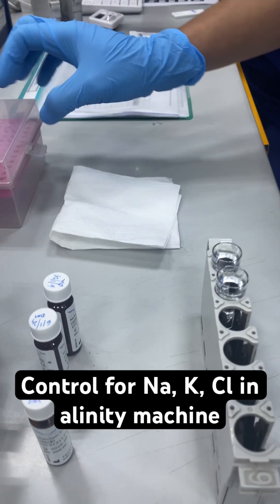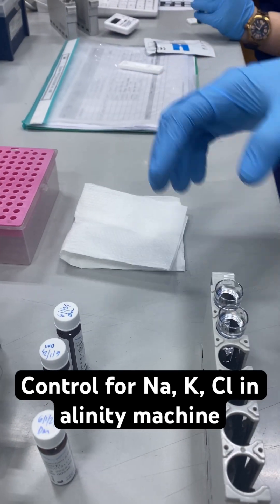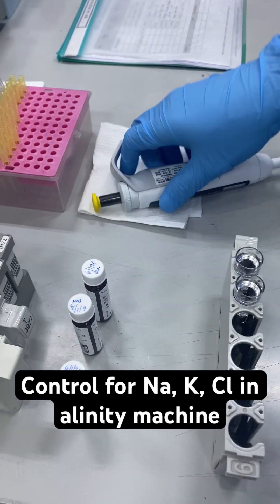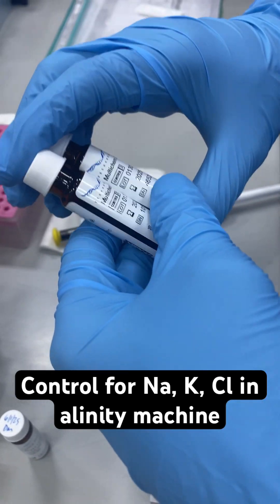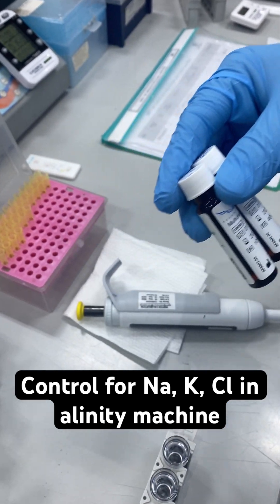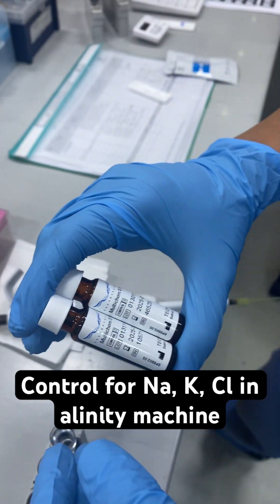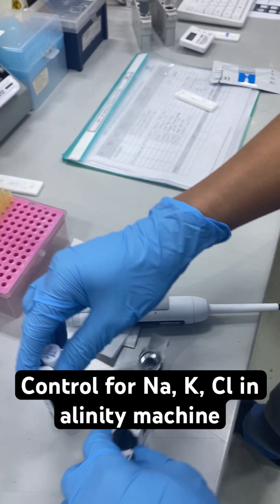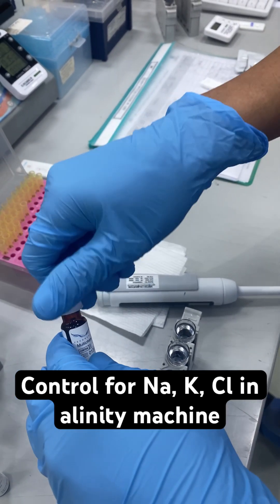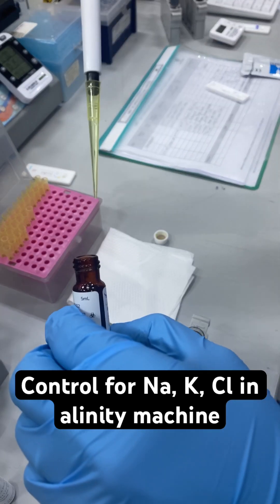So we will start now. First, make sure that the controls are already standing at room temperature for 15 to 20 minutes. Mix carefully — shake or rotate. Then take 100 µL each.